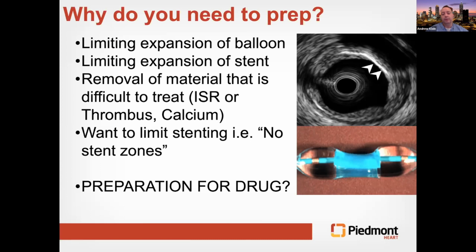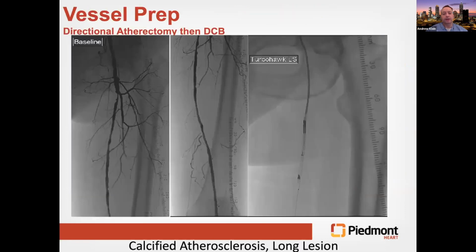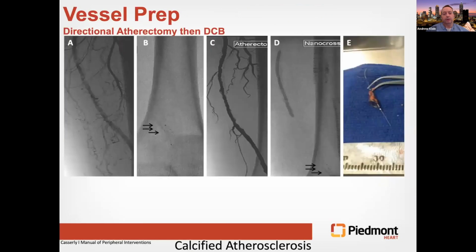And then I bring up the question, is preparation for drug a reason to prep, and why we need to do it? And I think it is. Let's talk a little bit about some of the data that's out there, and when it comes to cases, I'm just going to show a couple of cases where I use vessel prep essentially for drugs.